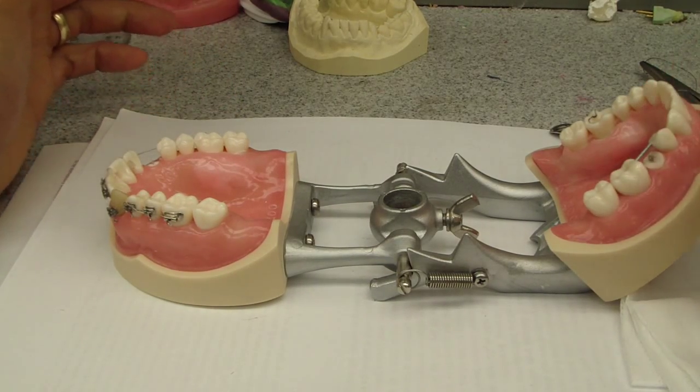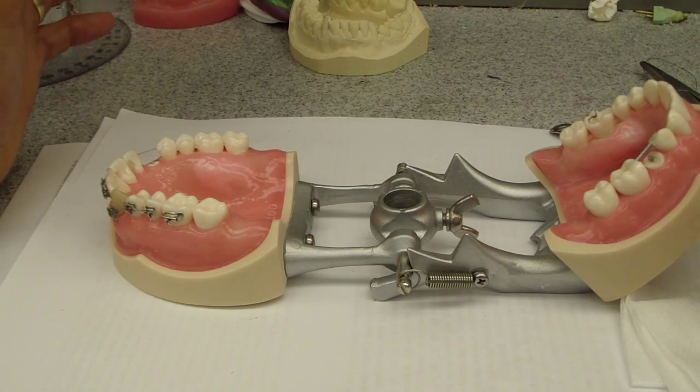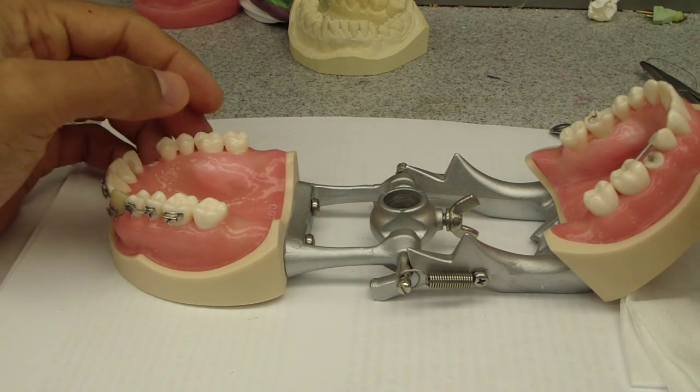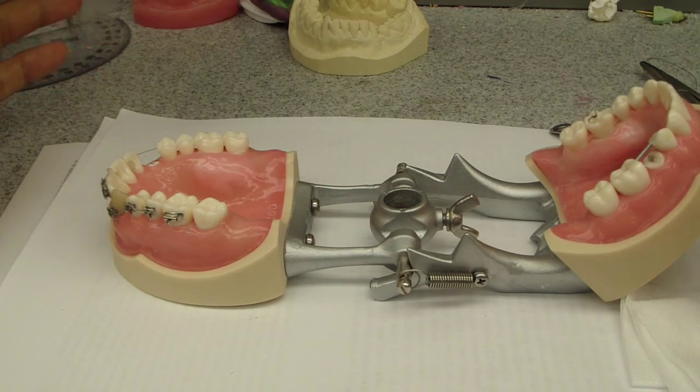Hey folks, Ashley here, allthingsendustry.com. We're talking about — I was just completing a crown lengthening procedure today on the maxillary left. One of the approaches that we have been taught and discussed at length is the lingual or palatal approach, rather than a straight buccal.